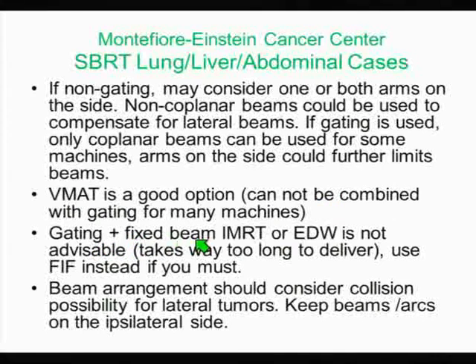Gating plus fixed beam IMRT or enhanced dynamic wedge is not as advisable because it takes way too long to deliver. So if you want to use some 1 or 2 segments, use field in field instead if you must use it. Beam arrangement should always consider collision possibility. For lateral tumors, you have to keep beams, arcs on the ipsilateral side.